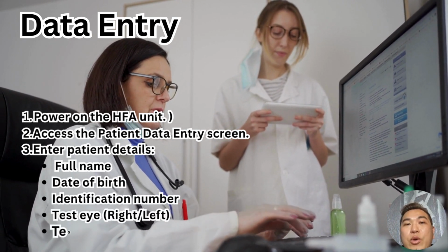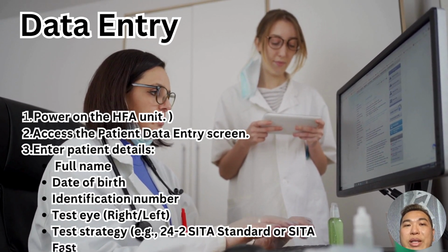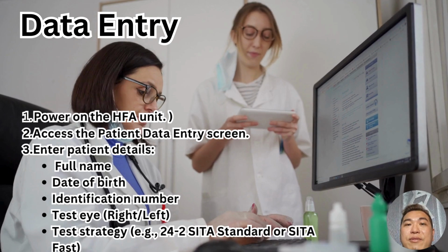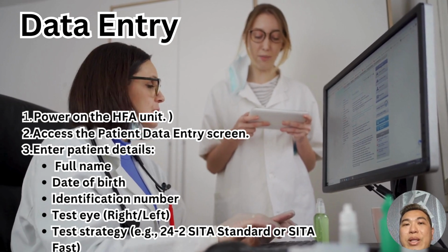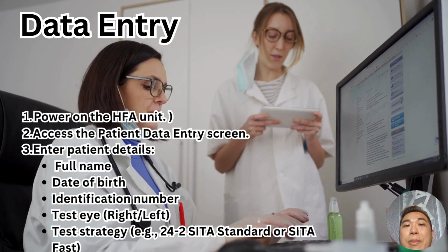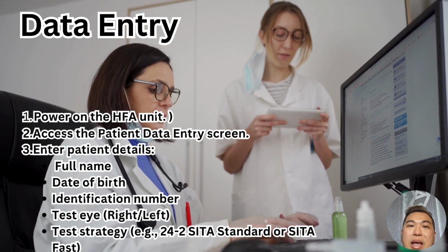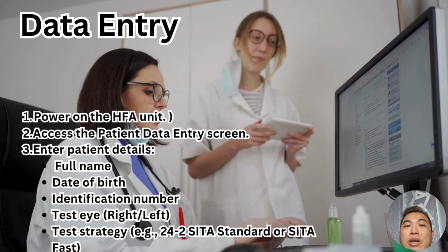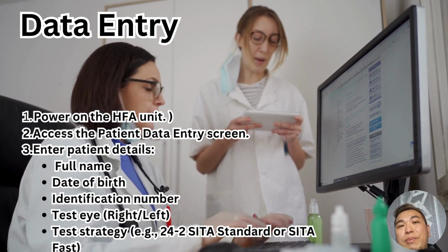Next, we select which eye will be tested, either the right or the left, and choose the appropriate test strategy, such as SITA Standard or SITA Fast, depending on the clinical requirements. Accurate data entry is essential for proper record keeping, smooth follow-up, and reliable comparison with future test results. At this point, we will show a short video demonstrating the proper use of the Humphrey Visual Field Analyzer to conduct an eye examination for the patient.